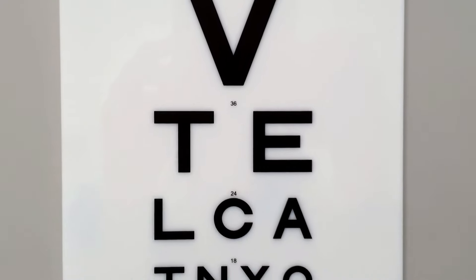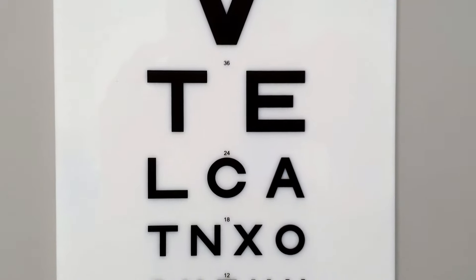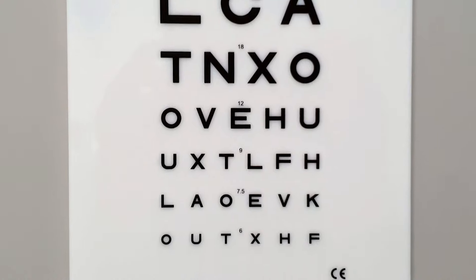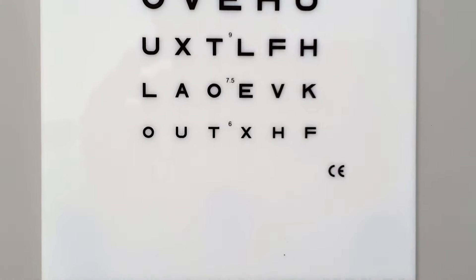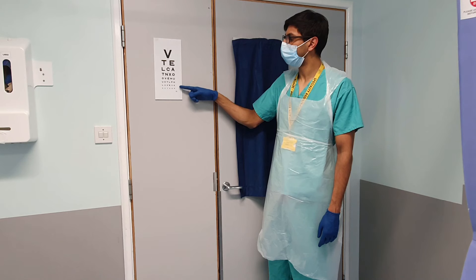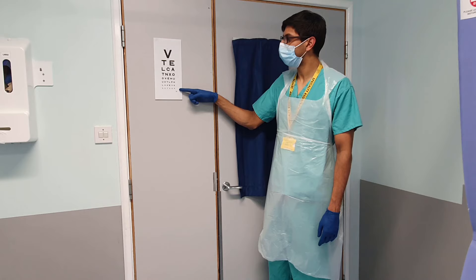On the Snellen chart, a small number represents each line — as shown here: 60, 36, 24, and so on. Visual acuity is expressed as a ratio recorded as x over y, where x is the testing distance such as 6 meters, and y is the line containing the smallest letter the patient can identify. A normal visual acuity is considered to be 6/6.